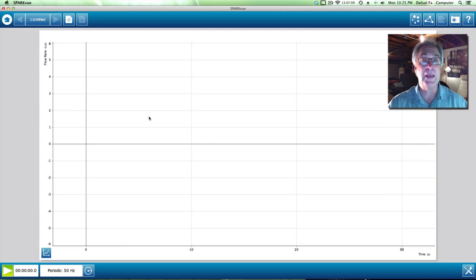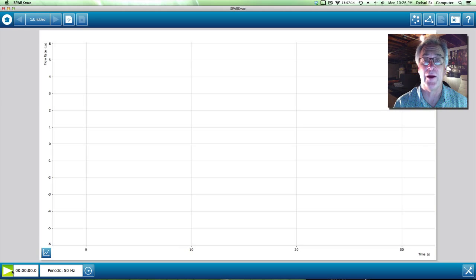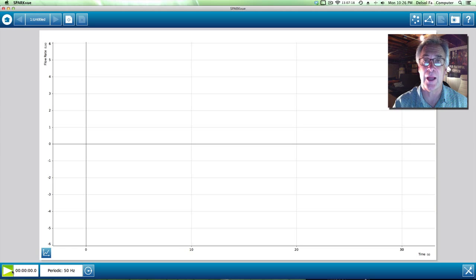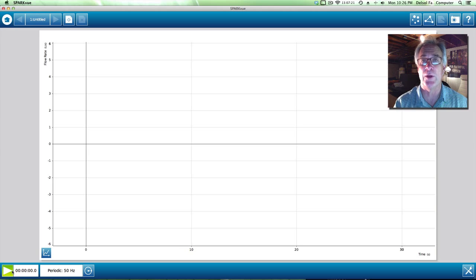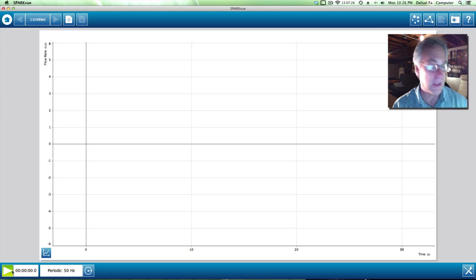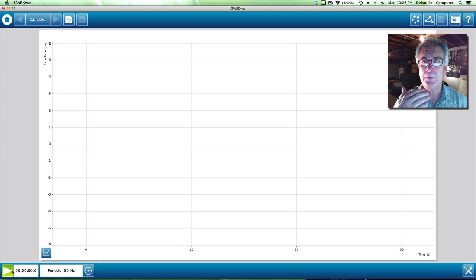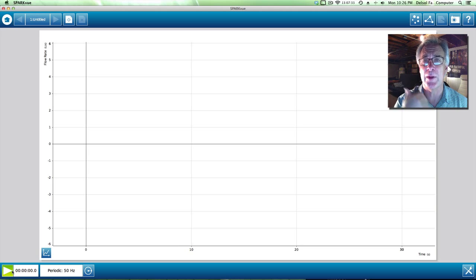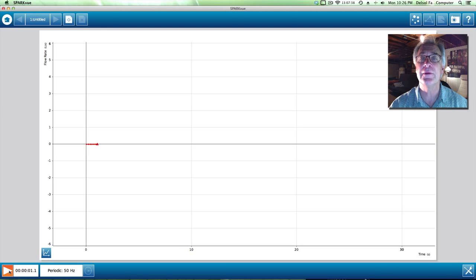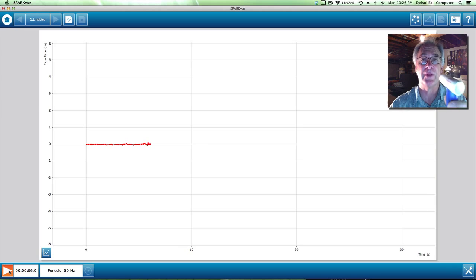Now, to make this happen, you first of all press play. Again, you look at the amplifier box, the wait light will blink red. Once it stops blinking, it will blink ready. Now, what it's doing when it's blinking red is it's calibrating the air around the mouthpiece so that it knows how much volume you're going to be breathing out in it. So I'm going to click the play button. And what's happening currently right now is the wait button has stopped. So I picked it up and it says ready.